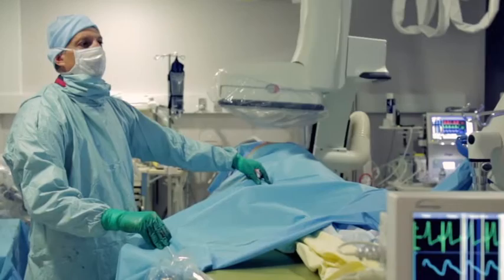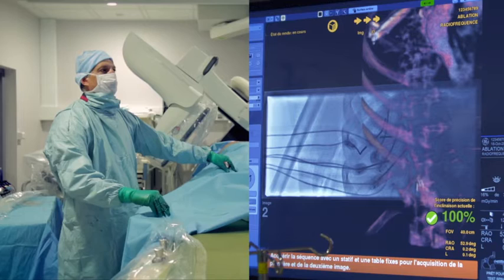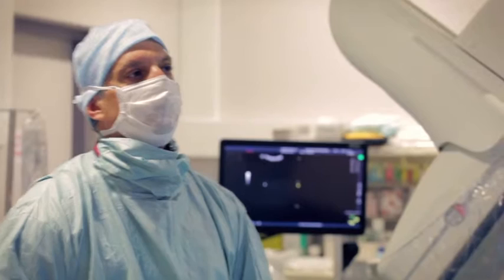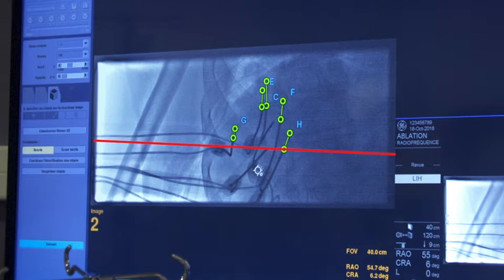For this, we take two fluoroscopy shots around the patient instead of a complete rotational acquisition. This saves both time and dose. We locate the needles quite easily in each view, and a red line is automatically displayed by the software to help match up the needles in each of the views.